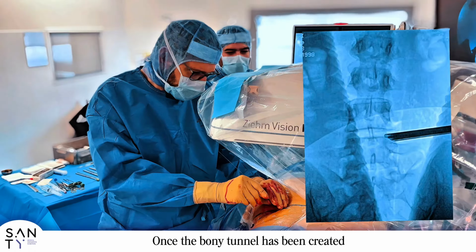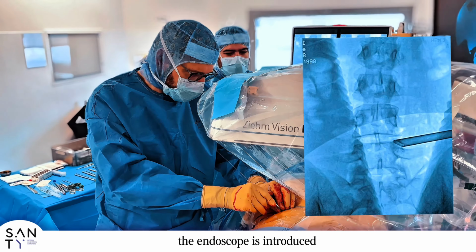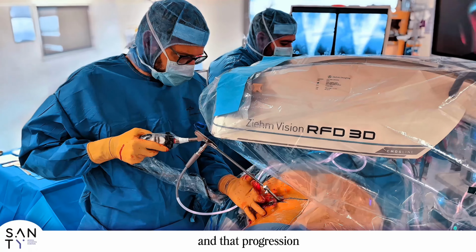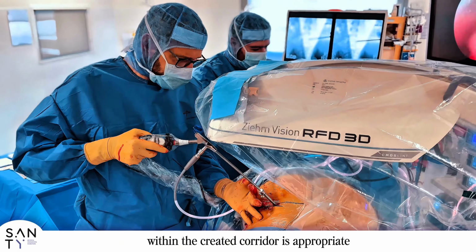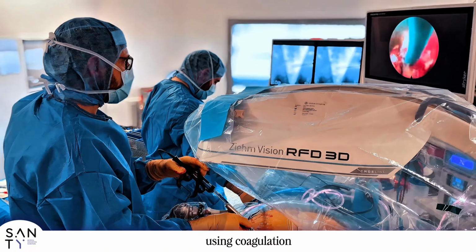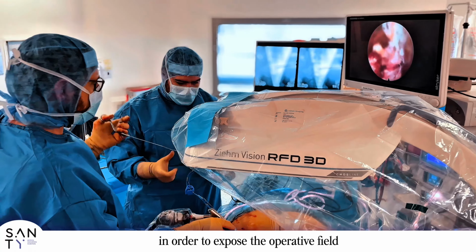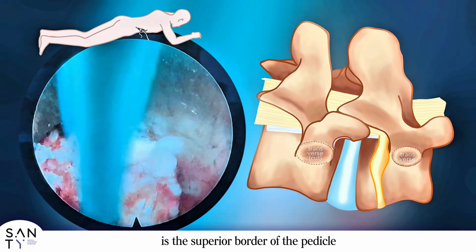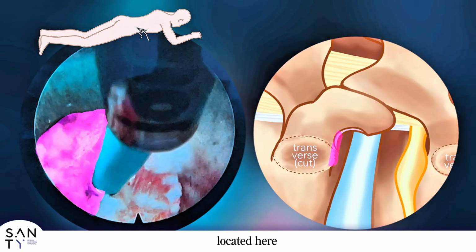Once the bony tunnel has been created, the endoscope is introduced under fluoroscopic guidance to verify that the working axis has not been altered and that progression within the created corridor is appropriate. At this stage, an initial soft tissue clearance is performed using coagulation in order to expose the operative field and achieve clear visualization. The first landmark to identify is the superior border of the pedicle located here.